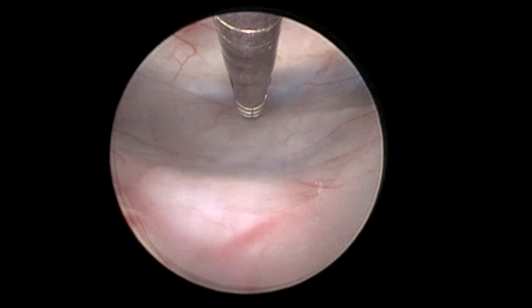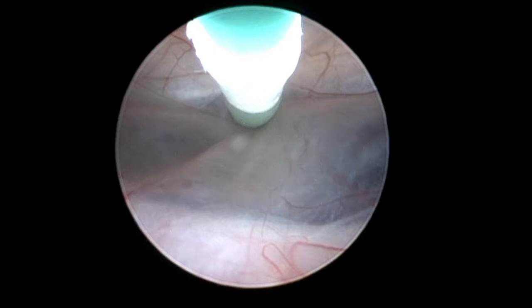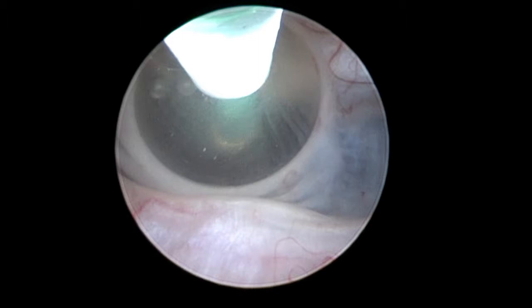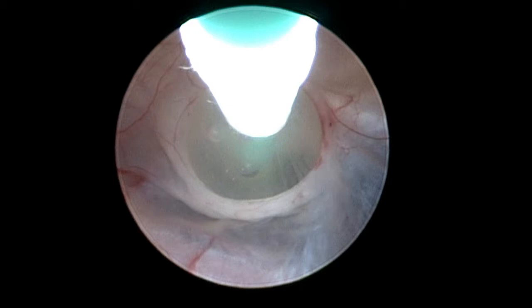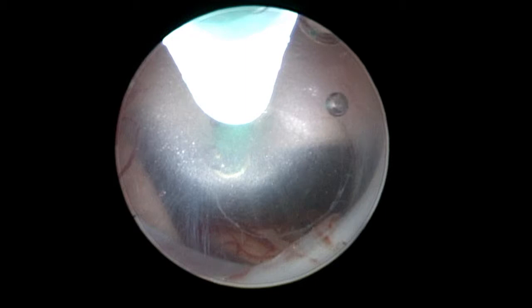The floor of the third ventricle is perforated using the DEC forceps. Then a three French Fogarty balloon catheter is introduced into the initial fenestration and the fenestration is carefully enlarged by slowly inflating the balloon. The balloon is prefilled with saline to enable slow enlargement, avoiding a pop-up phenomenon. Usually multiple inflations are necessary to create a wide opening of the floor and the underlying Liliquest membrane.